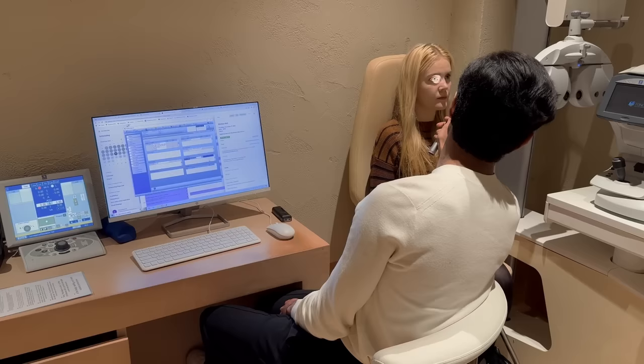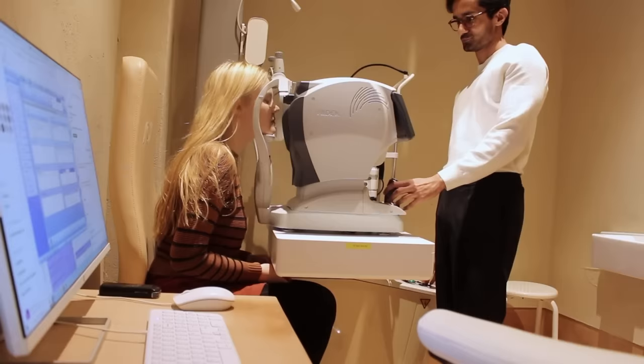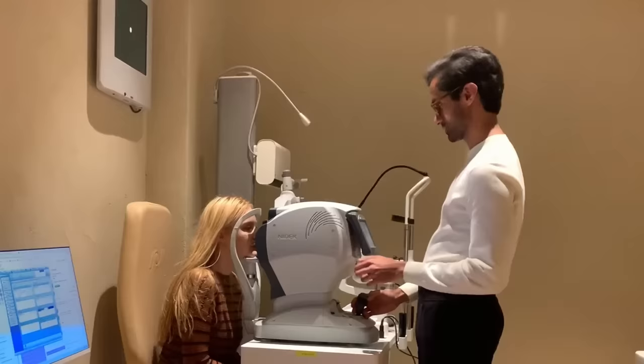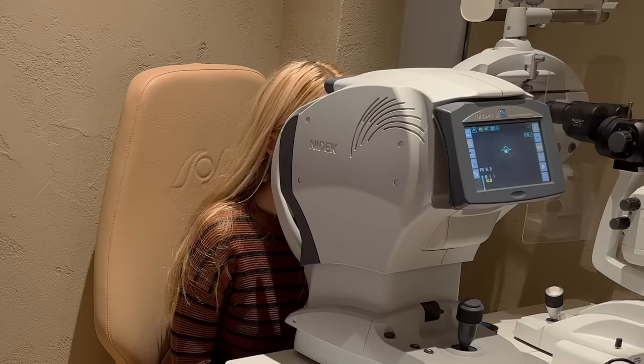Okay. So I'm going to pull this machine up in front of you. It kind of gives me an estimate of what your current vision's like. Okay? So can you just pop your chin onto there for me, please? Is that a comfortable height? So you can see an image of a hot air balloon. Yeah. Okay, let's keep looking at that. Let's go to the other eye.